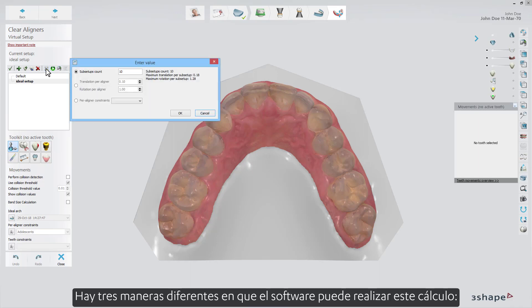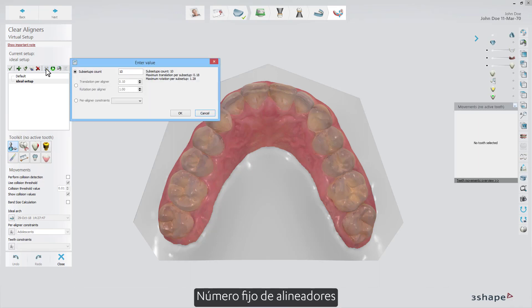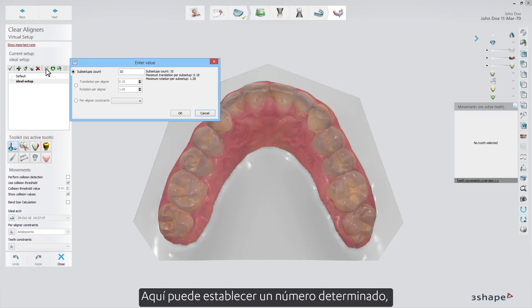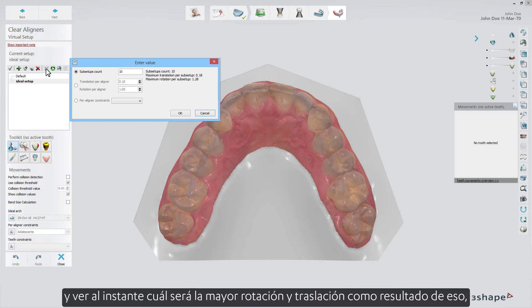There are three different ways the software can perform this calculation. The first is a fixed number of aligners, where you can set a given number and instantly see what the biggest rotation and translation will be as a result of that.